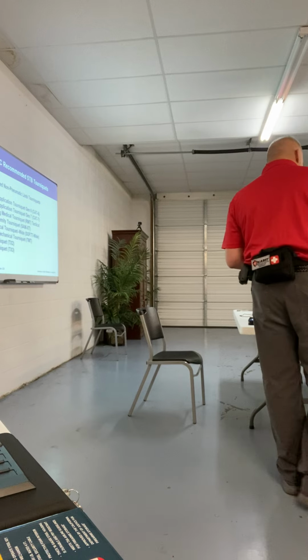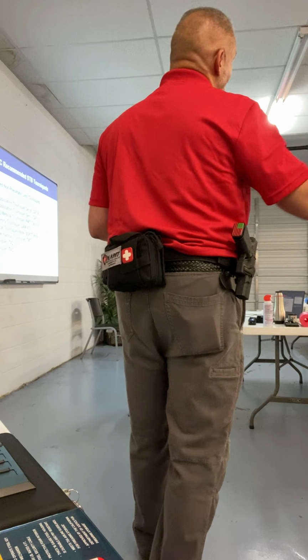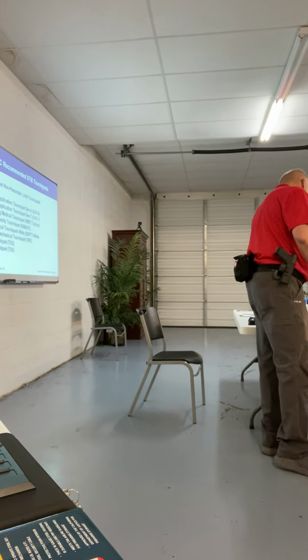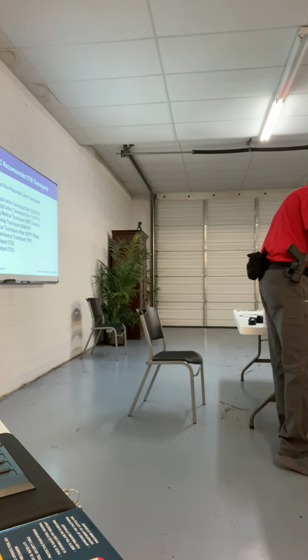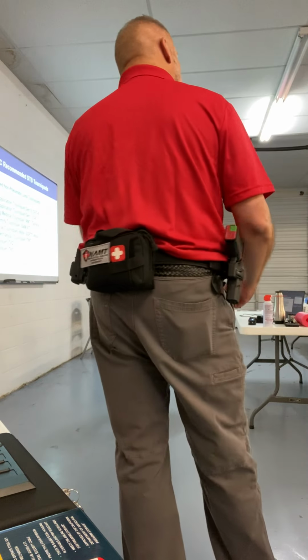I tested these with a Doppler. They work phenomenally. But I see why they're going out of business, because they infringe on somebody's copyright. So I don't recommend Recon Medical anymore. I used to, they would be on my list. But I'll still carry a Recon Medical too on my belt because I know it's good, I know it works.